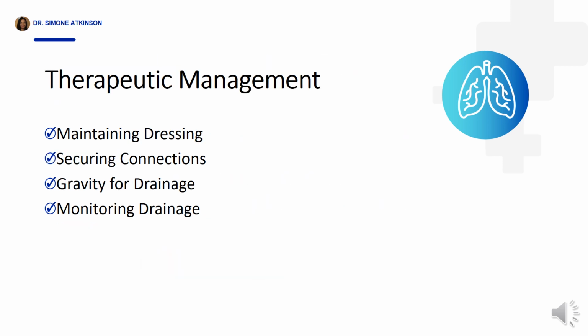Next, starting with the occlusive dressing maintenance, this step is integral to ensure meticulous application of an occlusive dressing, making sure it's securely anchored with wide tape or elastoplast at the insertion site. Now, should reinforcement be necessary, the advice is to consult with the healthcare provider for guidance if there are any modifications that are needed to the dressing.